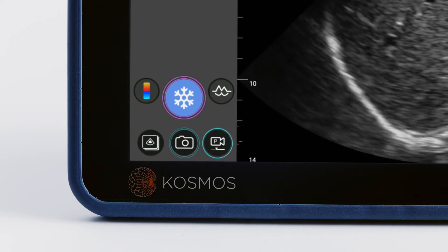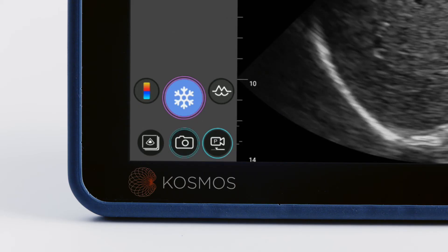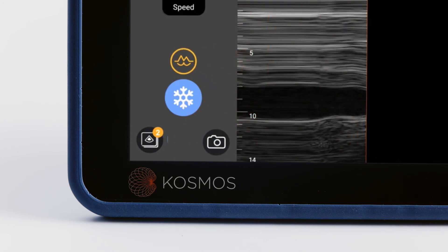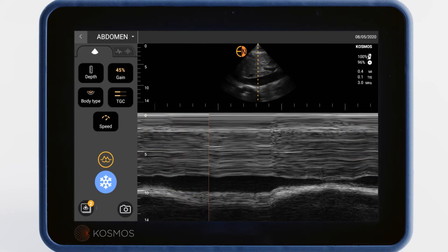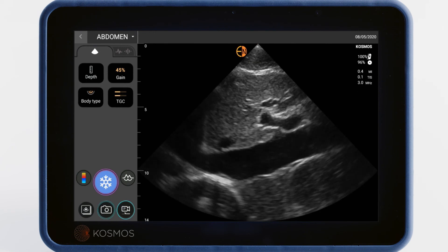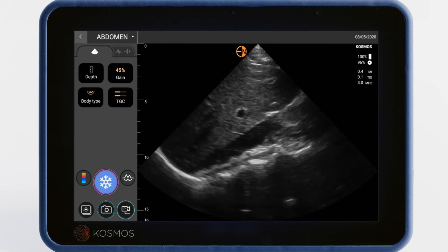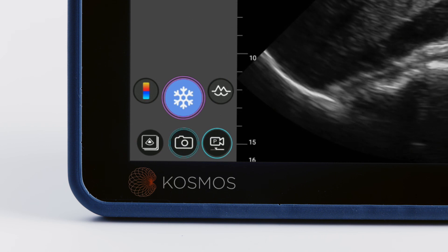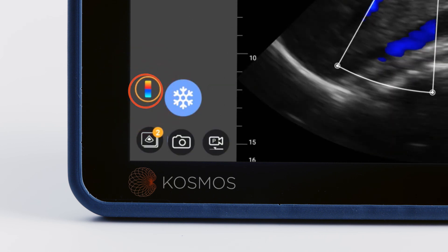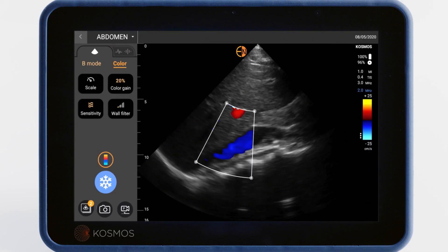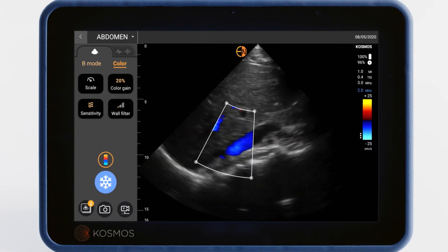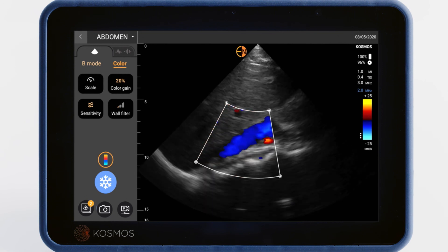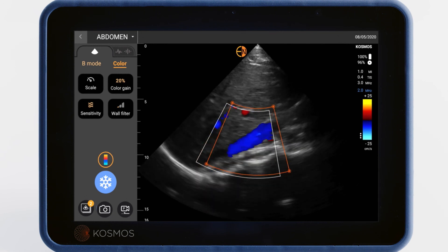If you would like to measure motion over time, turn on M mode by tapping the M mode button on the screen. Color Doppler is used to see the direction and velocity of blood flow. It can be turned on by tapping the color icon. The corners of the color box can be adjusted to resize it, and you can also drag the box into any position you'd like.